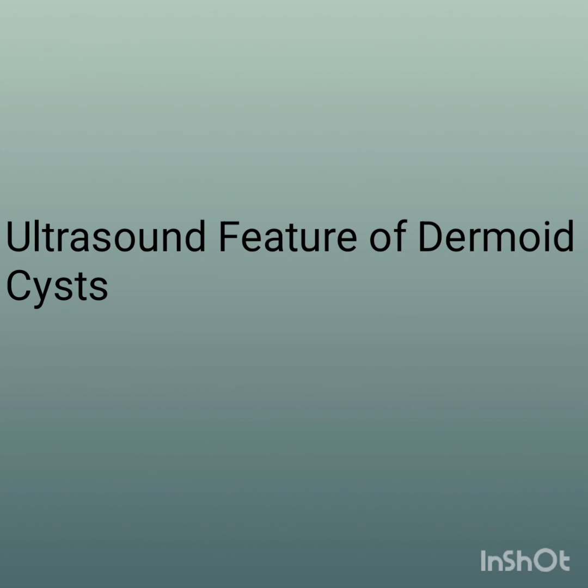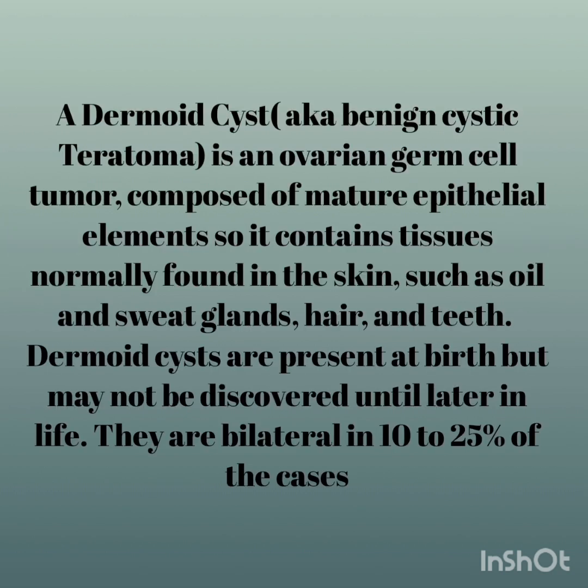The topic for today's video is the ultrasound features of a dermoid cyst. Now first let's talk about what is a dermoid cyst.